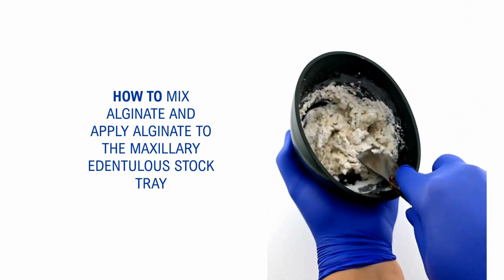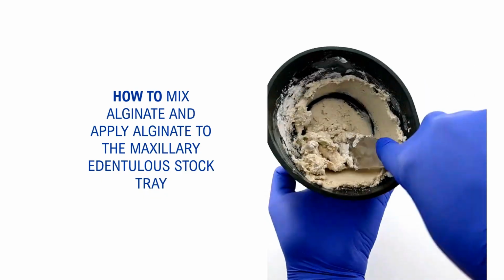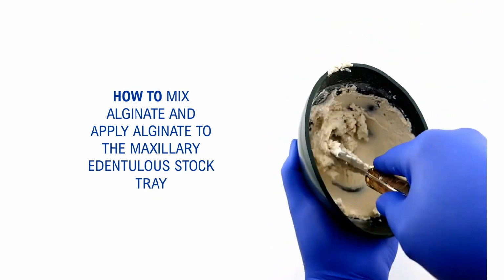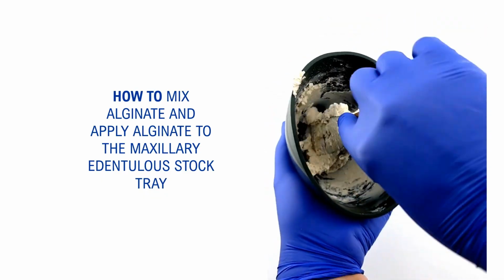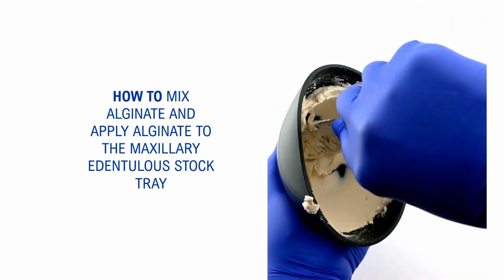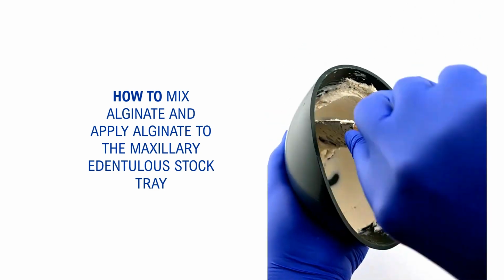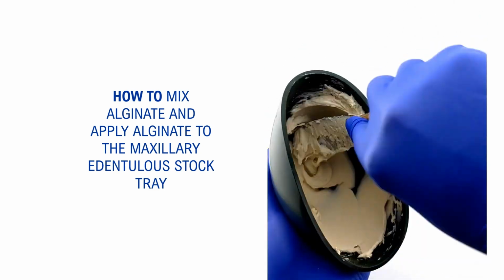Make sure it's as homogeneous as possible. And then at this point, you're going to start pressing your spatula against the green rubber bowl. You're going to have to do this multiple times until you have a creamy mix of alginate. So here I'm actually avoiding bubbles being created within the mix, and it should be as creamy as possible.